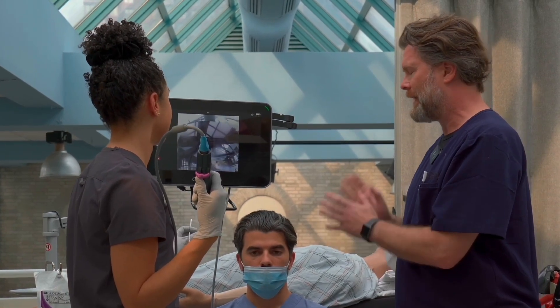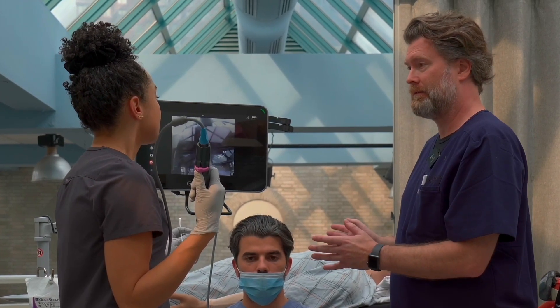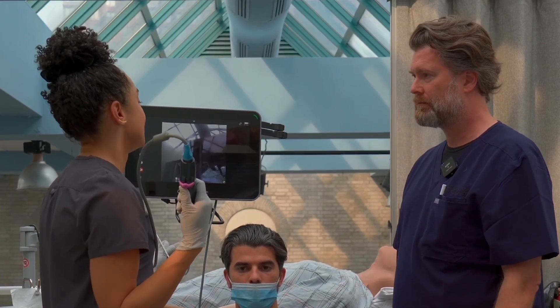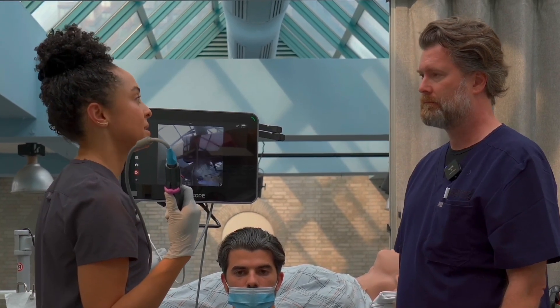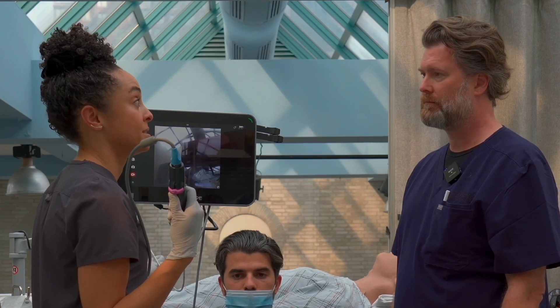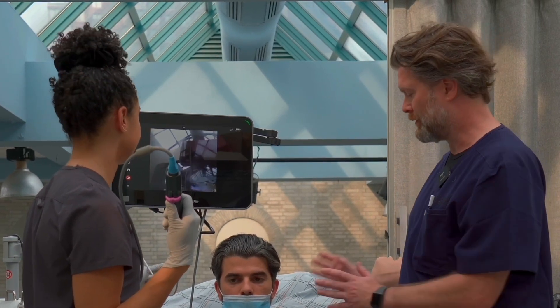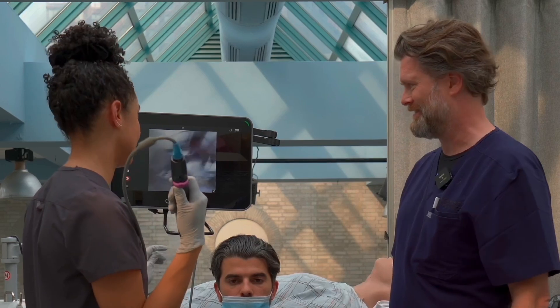If you don't see that dark opening and you just see a lot of obstruction, try to use the side that has the dark patch. And if you see a lot of pink at any point in the exam, just pull the scope backwards until you see black, which indicates the airway, and you can reorient yourself. So for this patient, we're going to go on the right nostril.